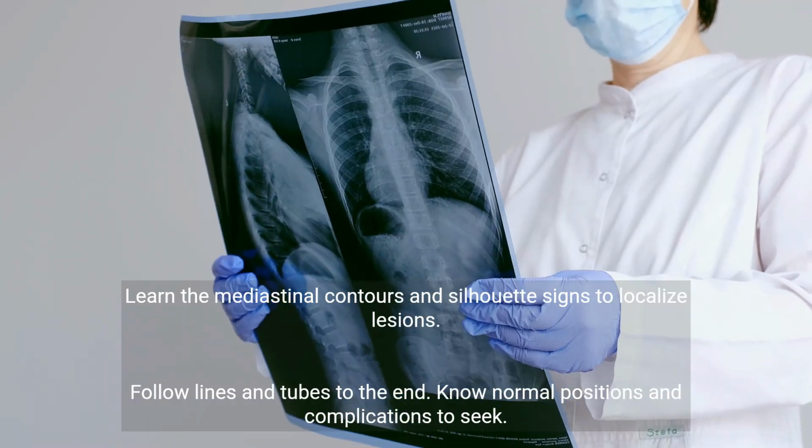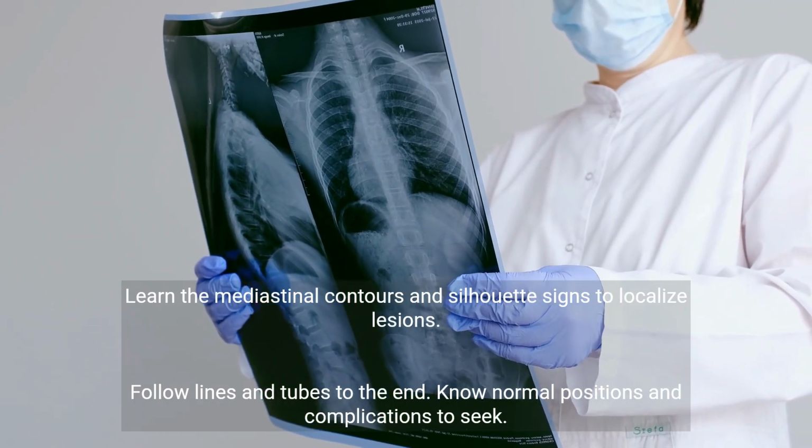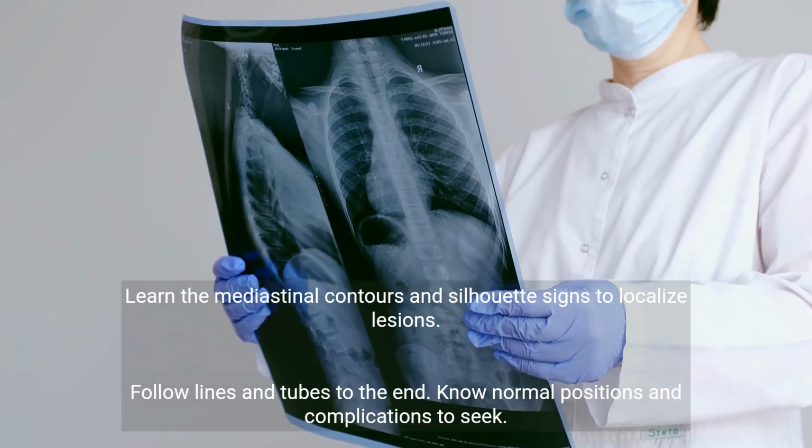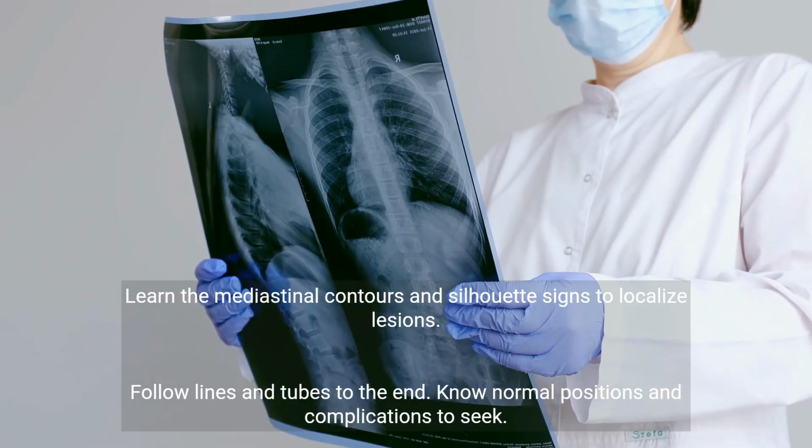Learn the mediastinal contours and silhouette signs to localize lesions. Follow lines and tubes to the end. Know normal positions and complications to seek.